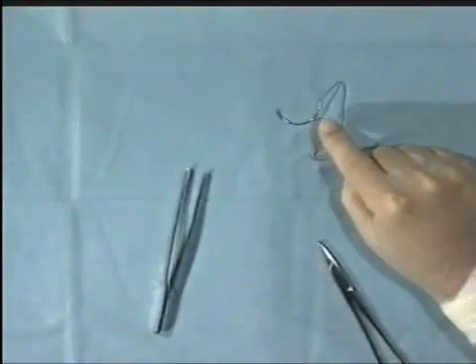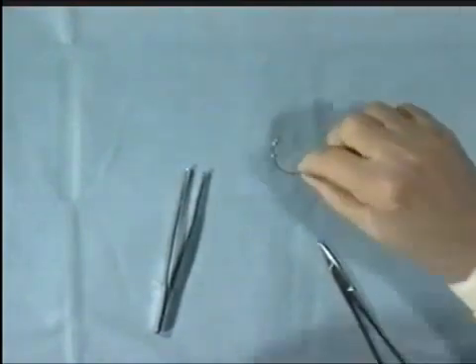When handling needles, never pick them up with your hands. It is important never to handle sharps directly like this.